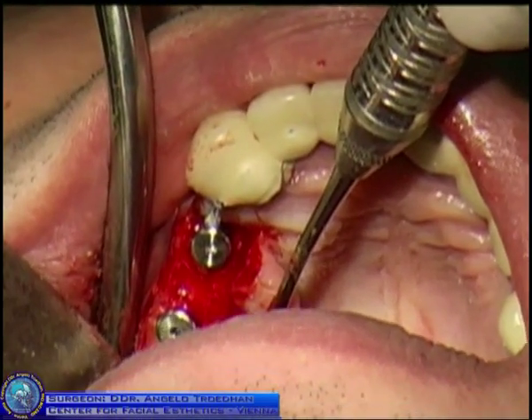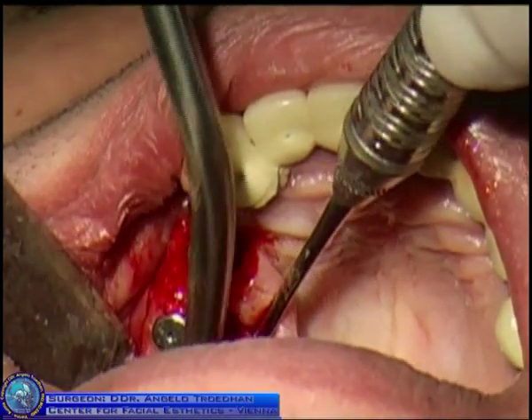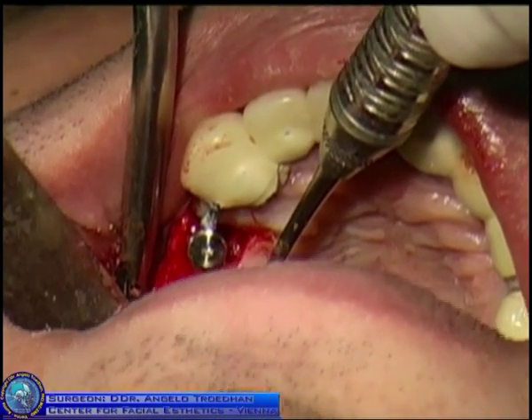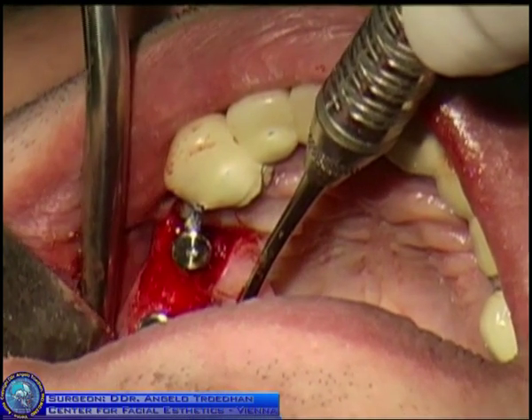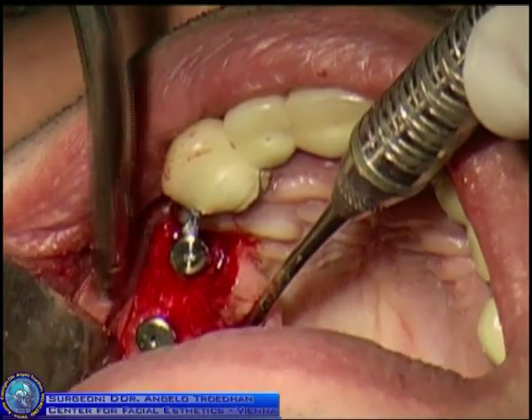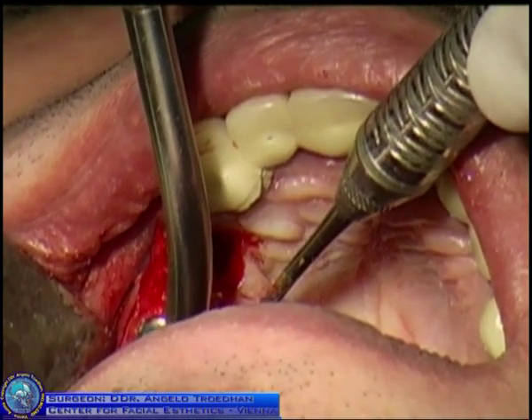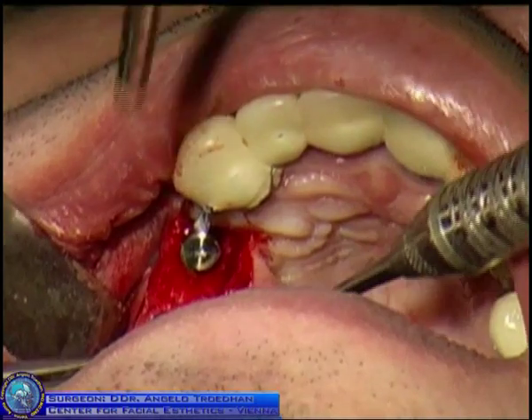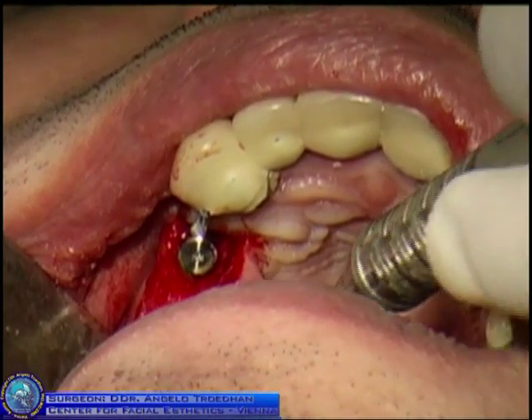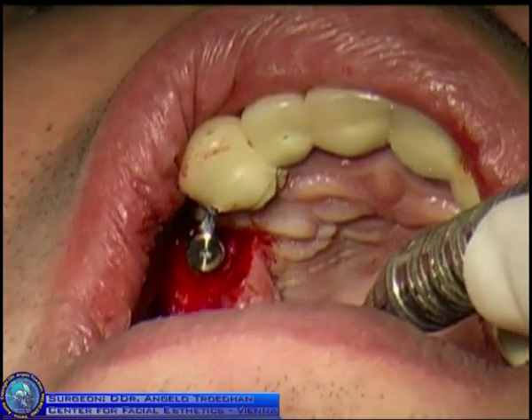So you see the minimum distance between these two implants is 4 millimeters. So this is absolutely sufficient. Of course, this is not an implant insertion I would present at an international congress. But honestly speaking, it doesn't matter, because they will work. And the main load will always be in the molar region. So it's better to have the implants here instead of up here. The only thing is I could have centered them a little bit better.